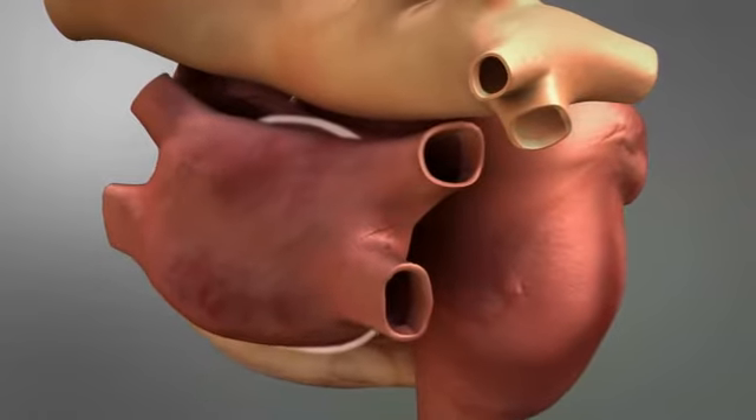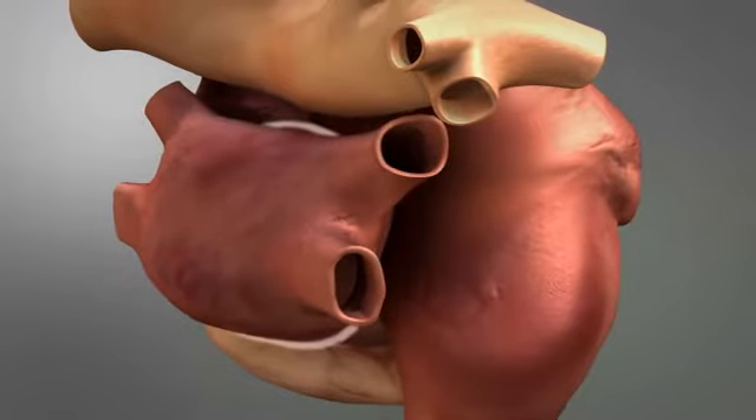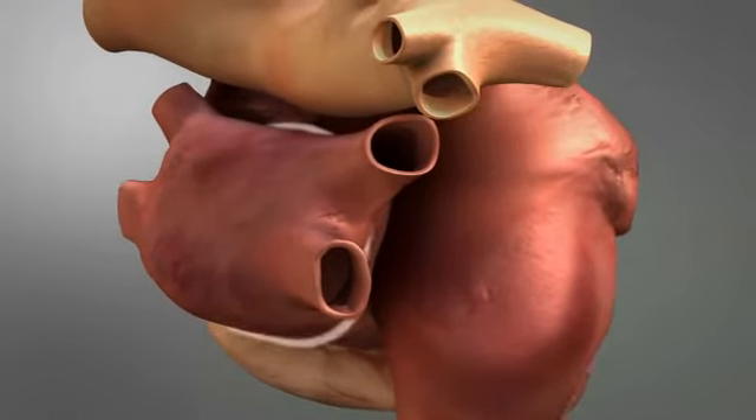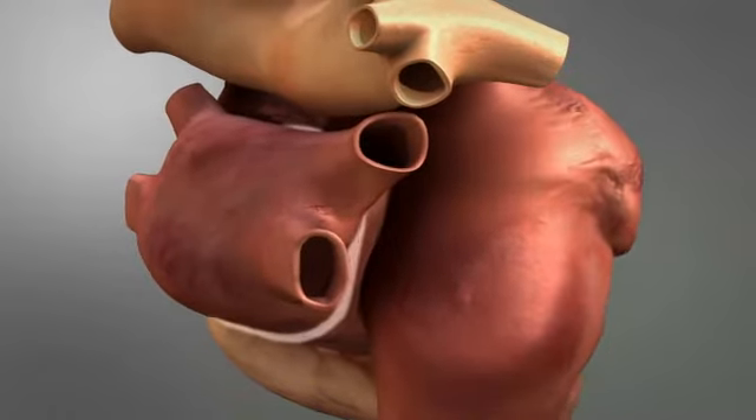The S-TECH COBRA fusion is the only device with versipolar technology, which can deliver both bipolar and monopolar energy, so surgeons can easily and efficiently create reproducible transmural lesions with more flexibility, confidence, and control.